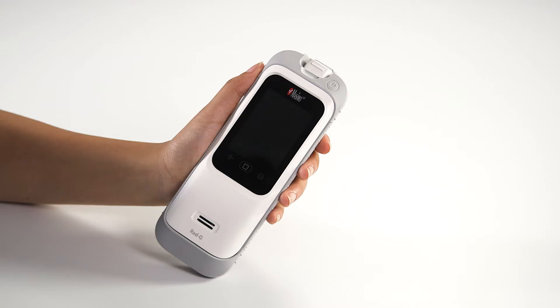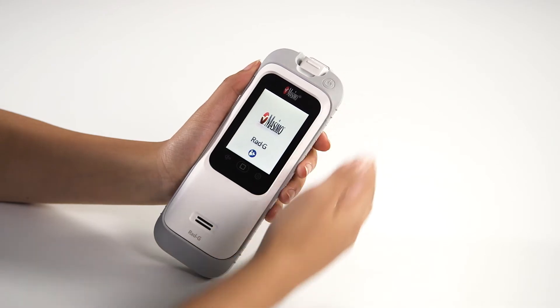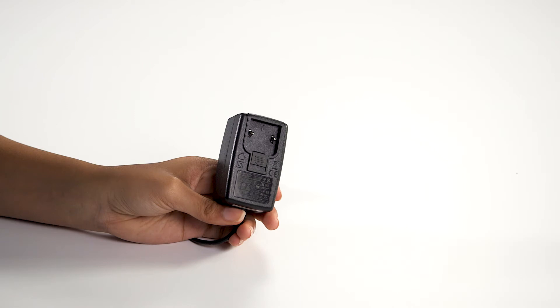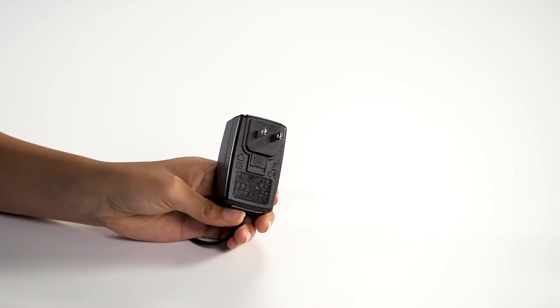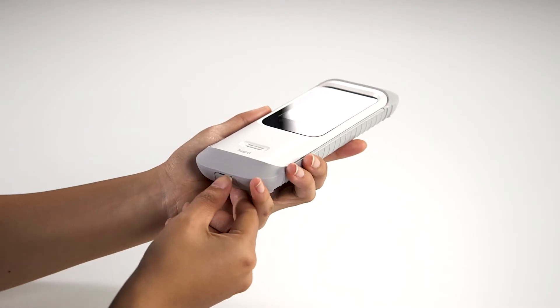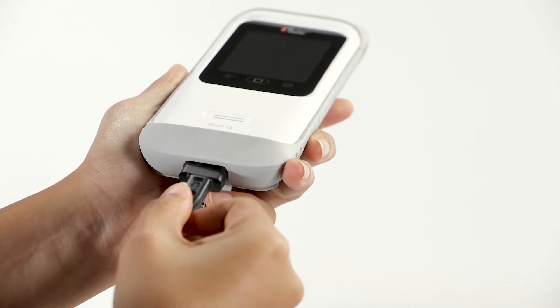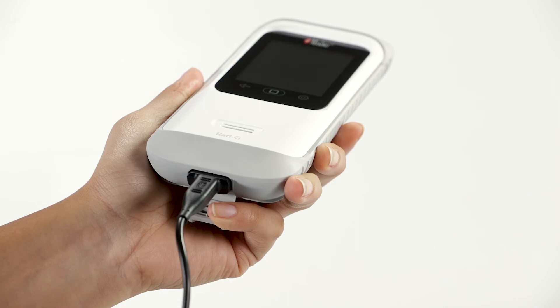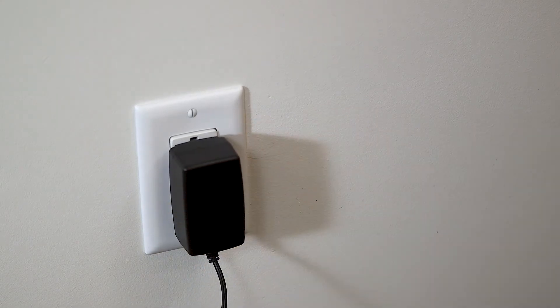Power on the RadG device by pressing the on-off button. Ensure that the RadG is fully charged. To charge the RadG, use the power cord and plug assembly insert included in the box. Insert the tip of the appropriate plug assembly insert into the power supply at a 30 to 60 degree angle. Plug the AC power supply cord into the bottom of the RadG device, verifying the plug orientation is correct during connection. Plug the other end of the power supply cord into an AC power source.